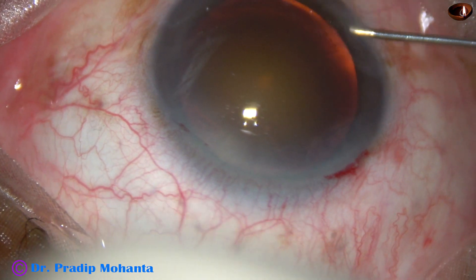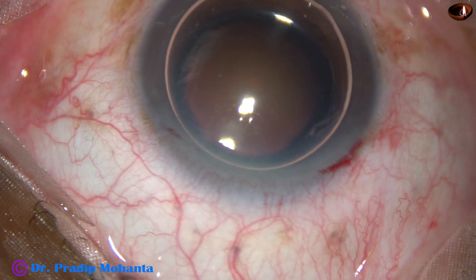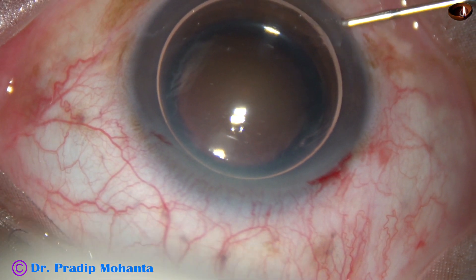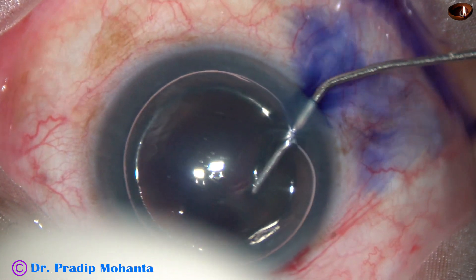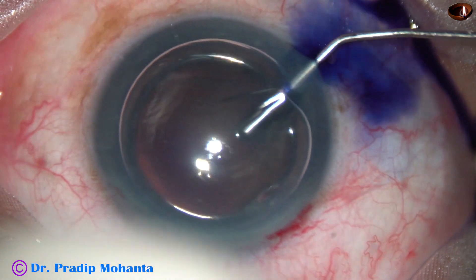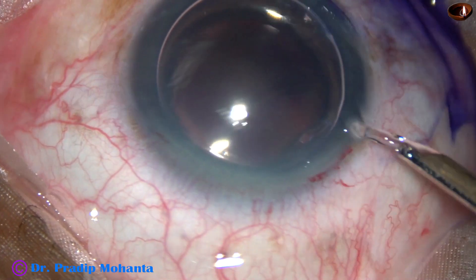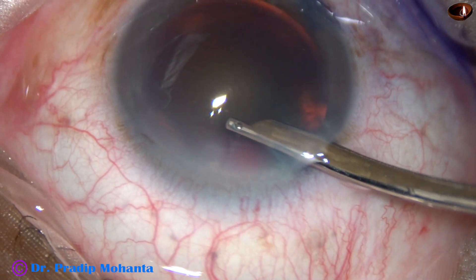An air bubble is injected into the anterior chamber. Beneath this air bubble, trypan blue dye is applied over the anterior capsule of this brown cataract to get some contrast during capsulorhexis. The dye is then washed out using BSS.